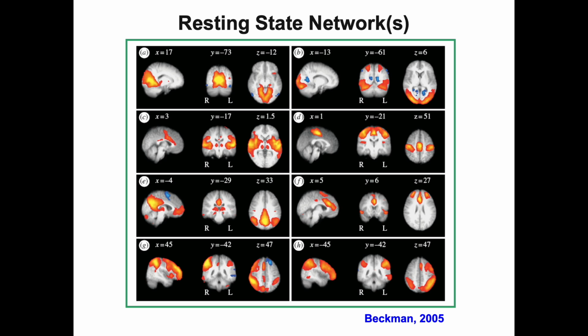Thus, from a single resting state scan, we could identify a number of distinct functional networks, including visual, motor, default mode. In task activation, we would typically require a separate run for each network. Thus, while task activation fMRI has revolutionized our understanding of human brain function, task fMRI has some limitations. In a number of populations, including newborn infants, very old subjects and patient populations like Alzheimer's, severe TBI, coma, there are issues of compliance. In these cases, resting state fMRI can serve as an alternative for mapping brain function.